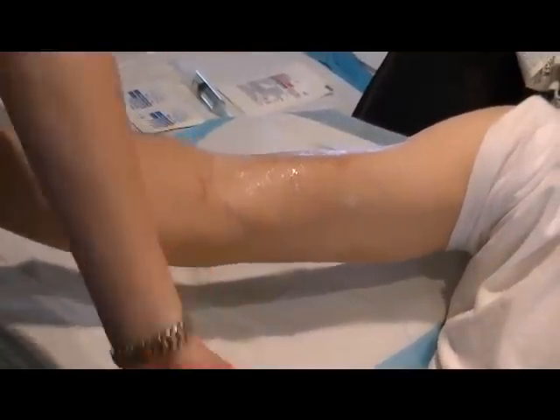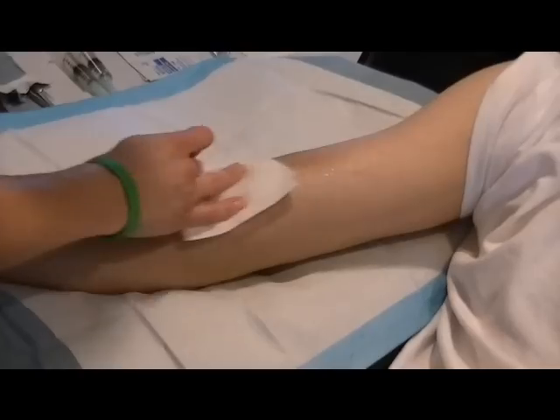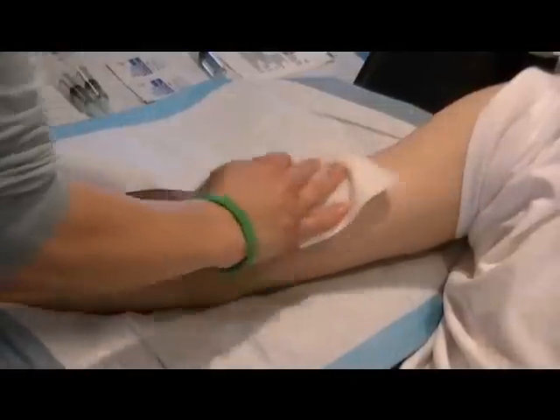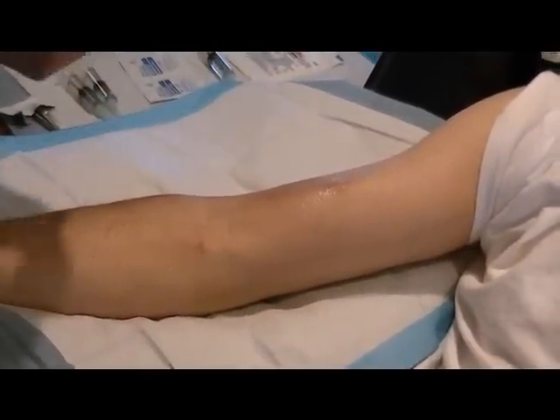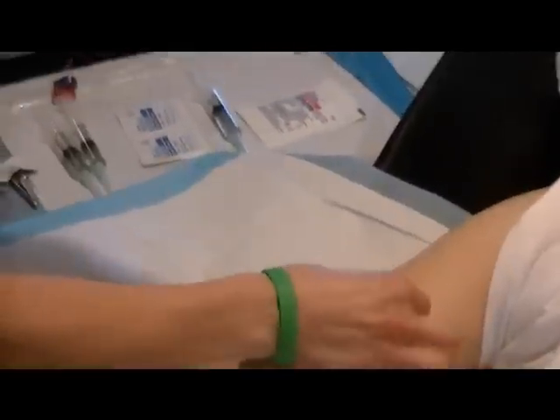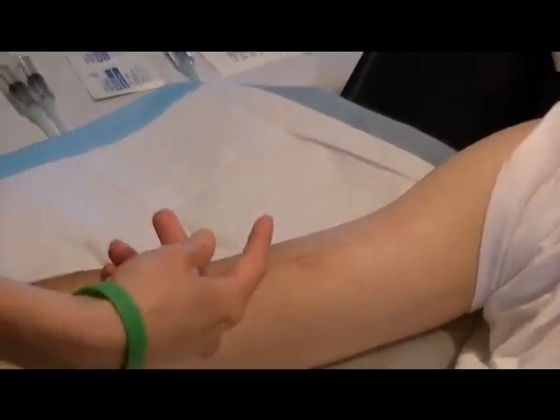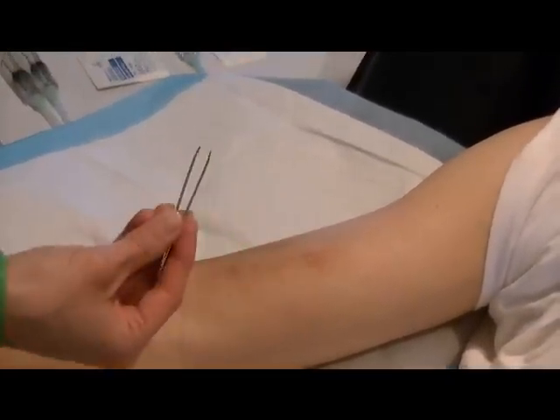We have some cleaning supplies here and we clean his arm off, then use alcohol to clean it up. We actually use the buttonhole technique where you use the same two holes every time. So you have to take tweezers and pick off the scabs before you actually put the needles in.